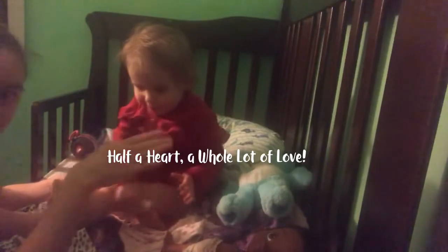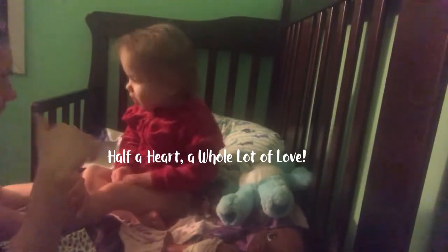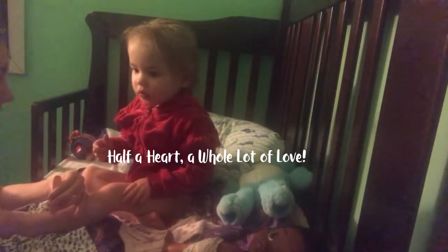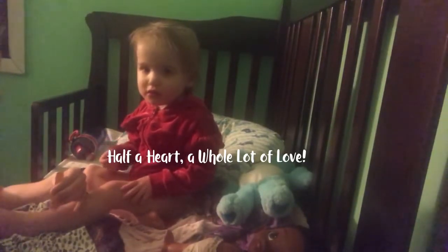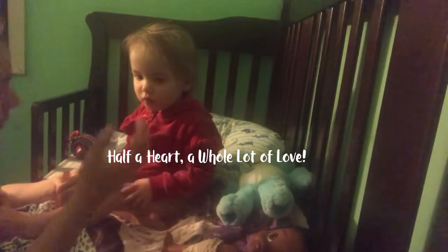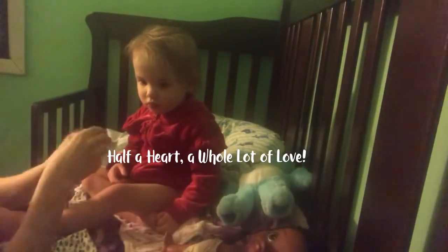Wipe, wipe, wipe. So this entire time, Amelia was asleep. Did you know that? You were sound asleep. So we would wipe, wipe, wipe, and then we would let it, this is key, air dry. You have to be patient while it air dries, and that way it's totally clean. See, if you wipe it with something afterwards, it's not clean anymore, is it? No, good job.